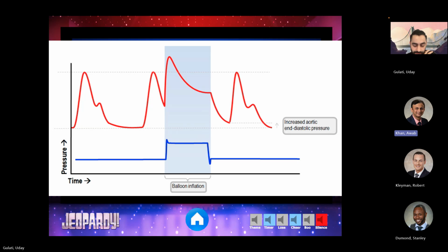Okay. The only thing you can do is adjust from being triggered by the electrical markers, like the ECG markings, to having them pressure triggered. So if one is not working and it's inflated too early, it could just be misinterpretation of the electrical activity, so you can change it to pressure. And then it should theoretically not go too early because it's pressure triggered.